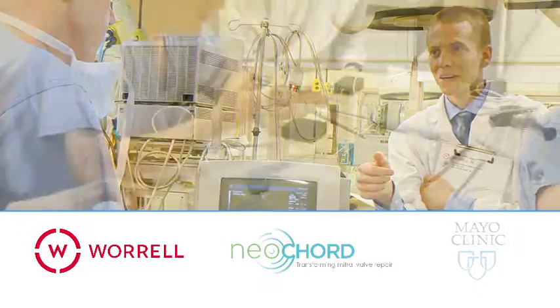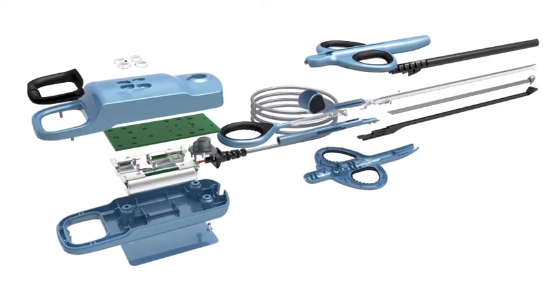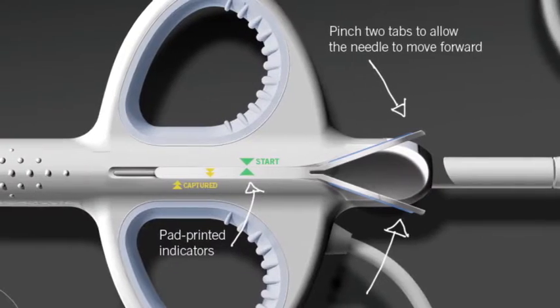Worrell Design, in collaboration with Neocord Inc. and the Mayo Clinic, developed the DS-1000 — a simple-to-use, low-cost disposable, and minimally invasive solution for replacing damaged tendons.